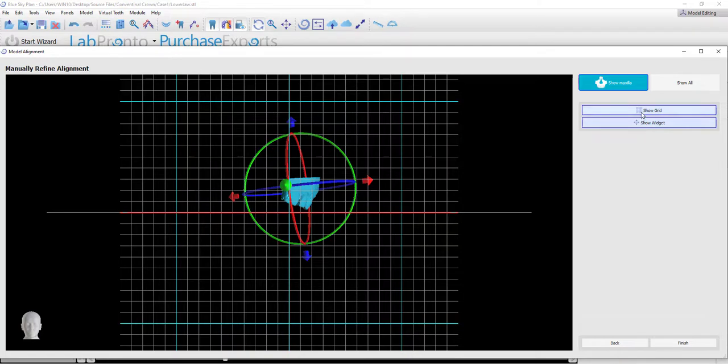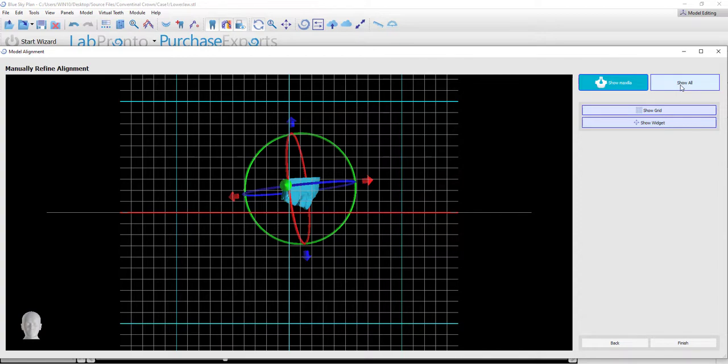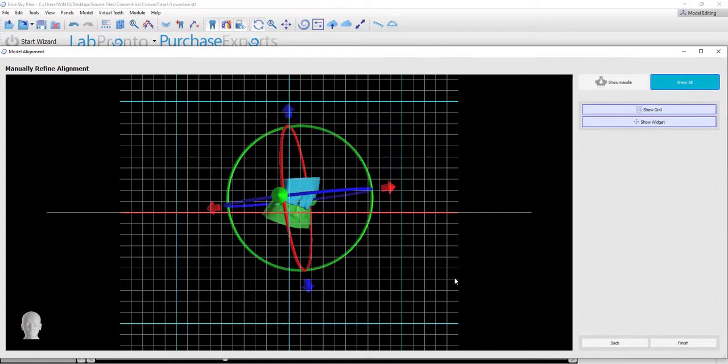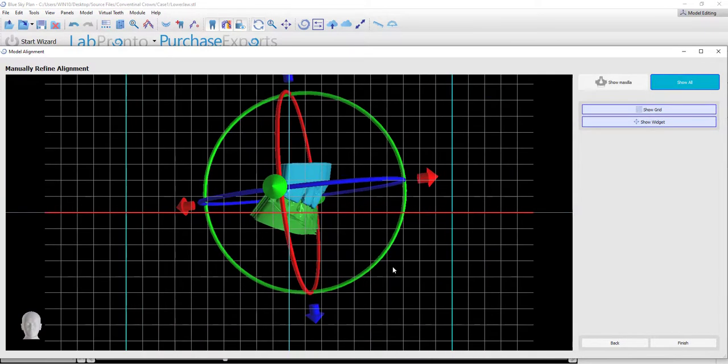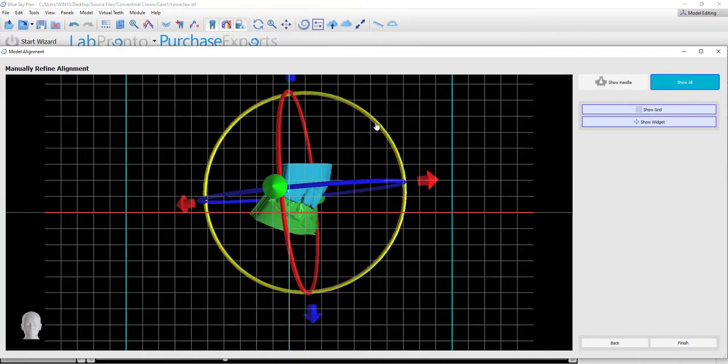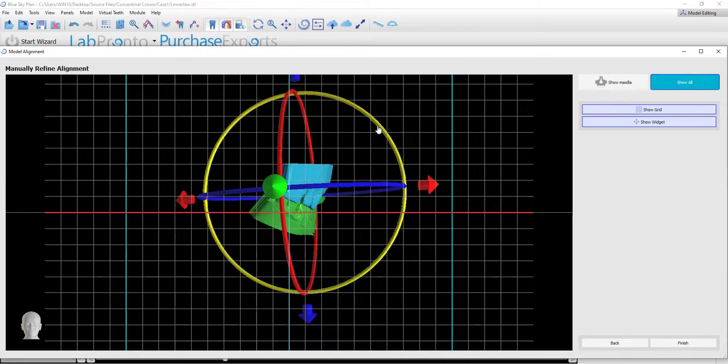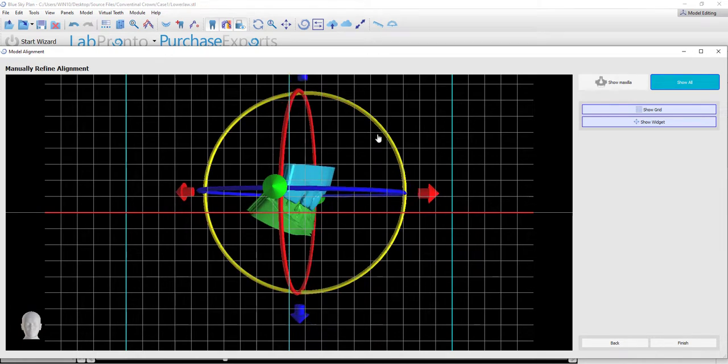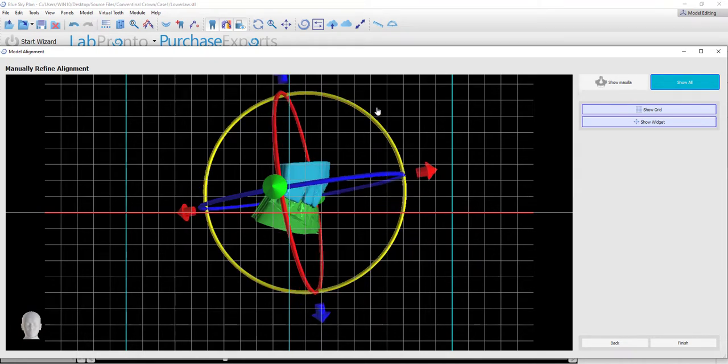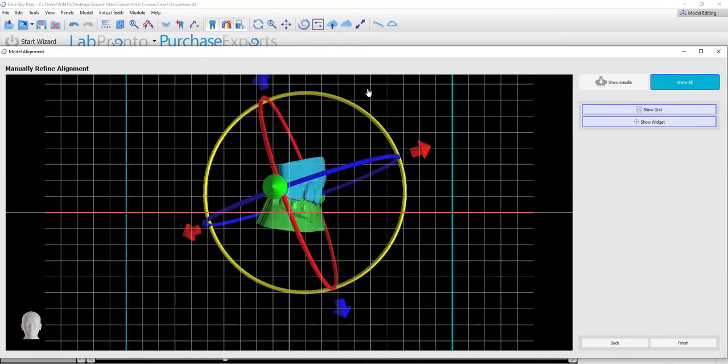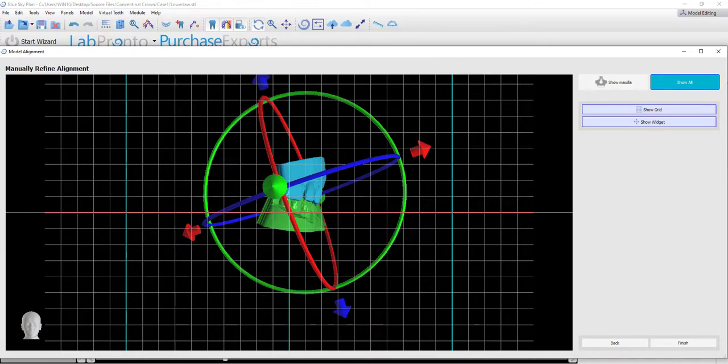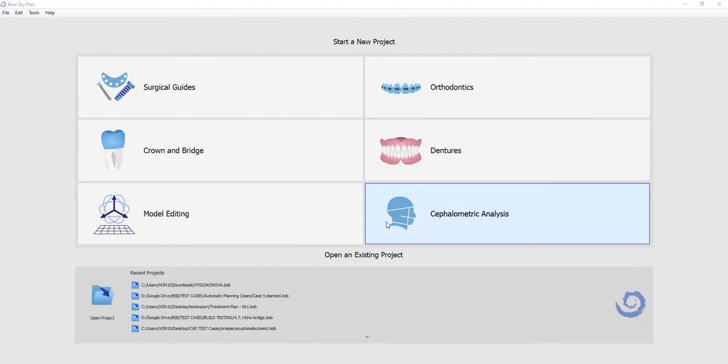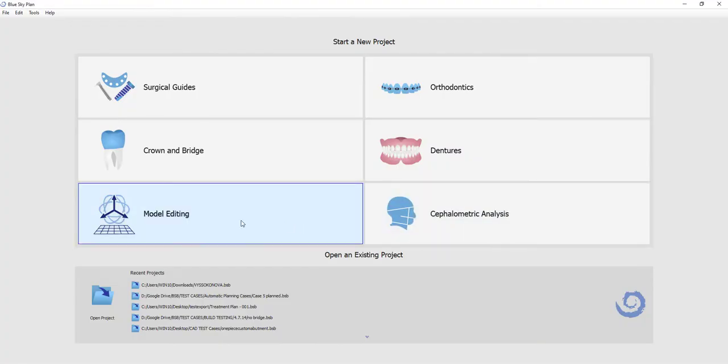We can toggle the grid on and off as well as the movement widget. We are able also to show all the models, and the model orientation to each other has been retained by the software. Once we have finished, we simply click the Finish button.